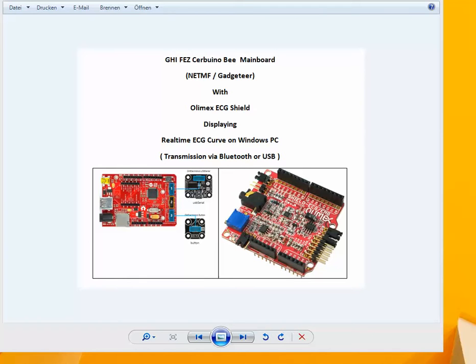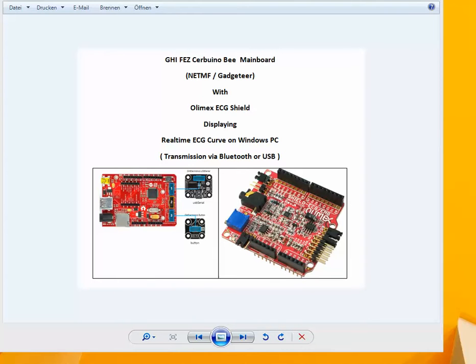Hello, this project shows the OLIMAX EZ-G shield on the GHA Electronics Serbuino B mainboard. Data transmission over Bluetooth.